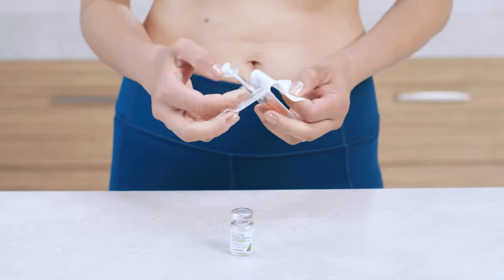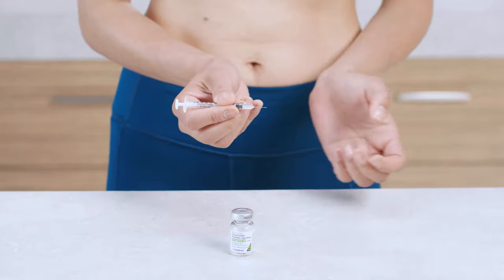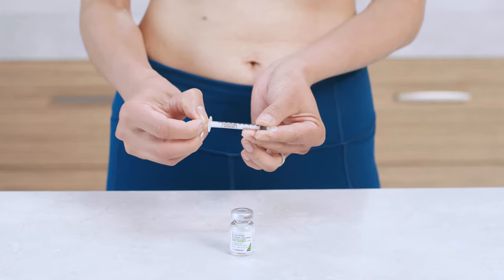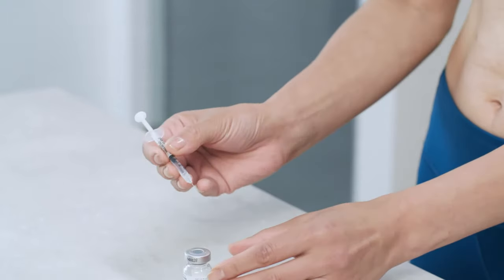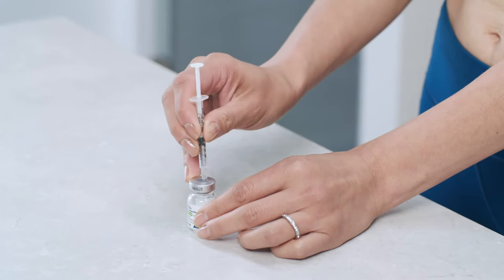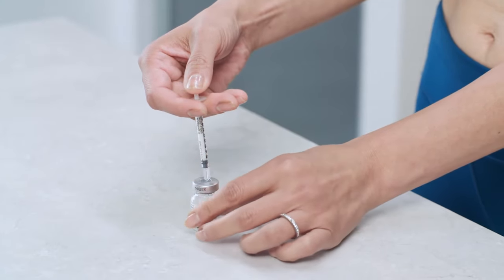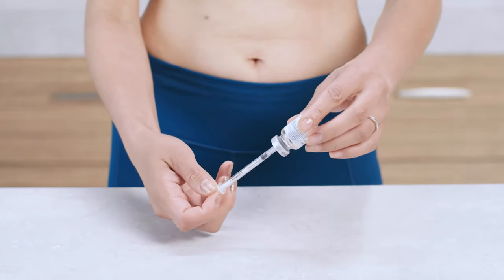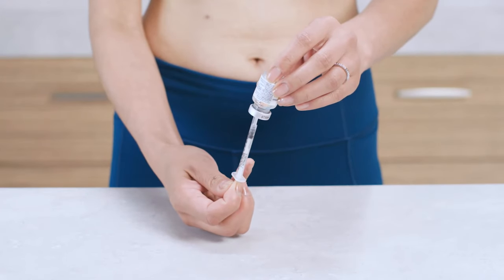Next, unwrap the syringe and remove the needle cap. Draw air into the syringe by pulling back the plunger to the unit mark that matches your dose. For example, if your doctor prescribed 40 units, draw back to the 40 on the syringe. Place the vial on a flat surface and insert the needle through the rubber stopper and into the vial. Gently press the plunger all the way in, which pushes the air into the vial and makes it easier to withdraw. Then, without removing the needle, turn the vial upside down.